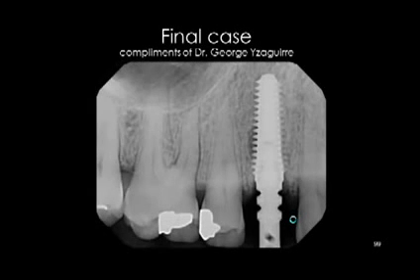Now, your implant was placed. One of the other tools that we have in the kit that really makes your life easy is these pathfinders. This pathfinder screws into the implant itself, as you can see here, so it doesn't fall out. And now you can really check your alignment as to where your implant placement is. If you need to move it, if you need to check it, that's another benefit of this implant system.